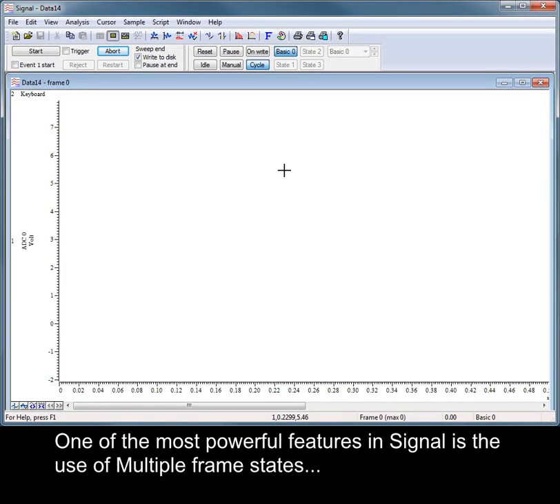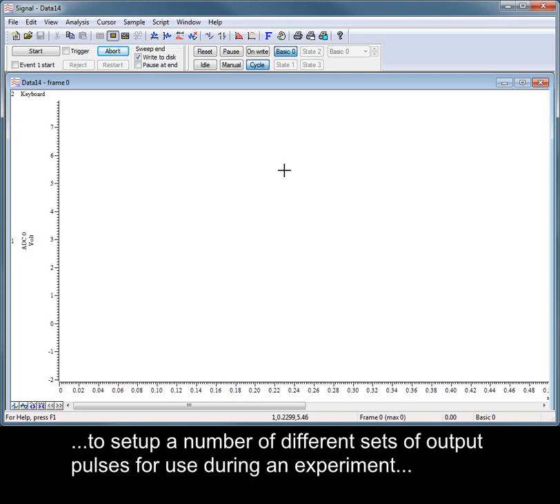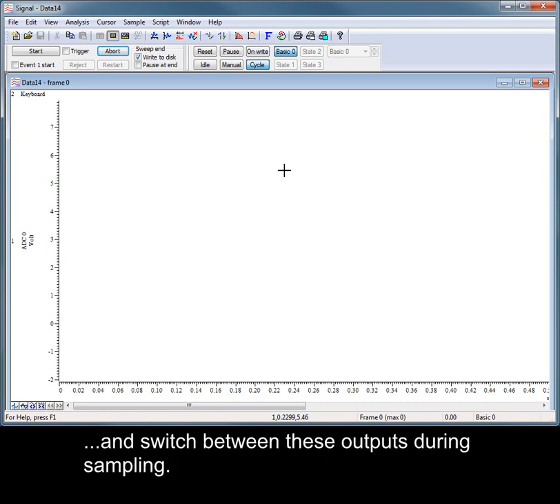One of the most powerful features in Signal is the use of multiple frame states to set up a number of different sets of output pulses for use during an experiment and switch between these outputs during sampling.